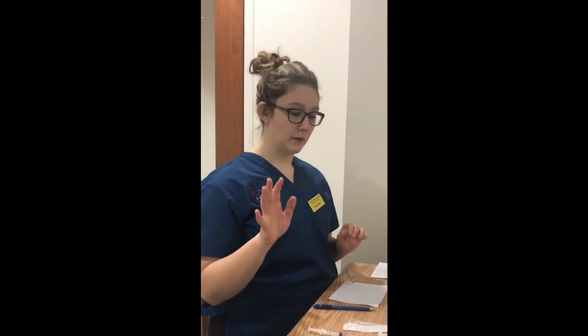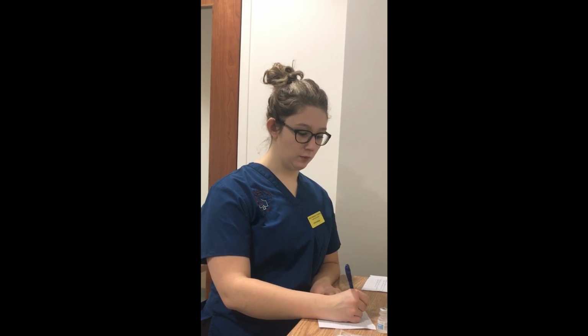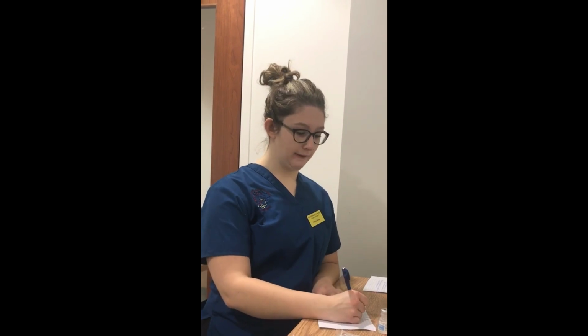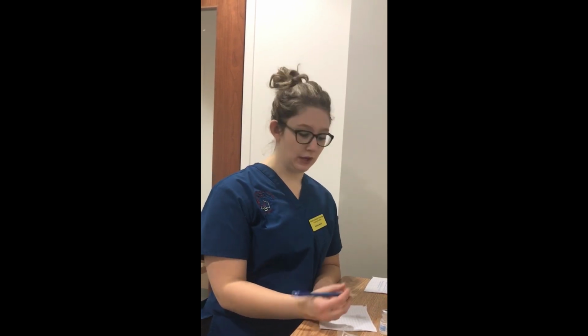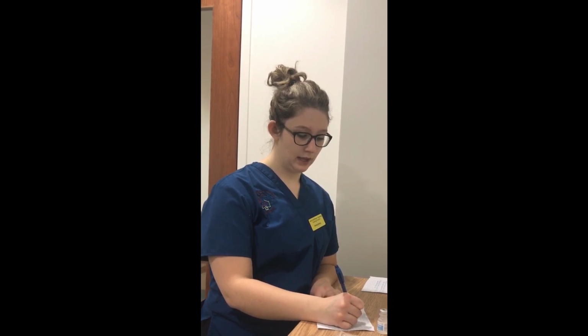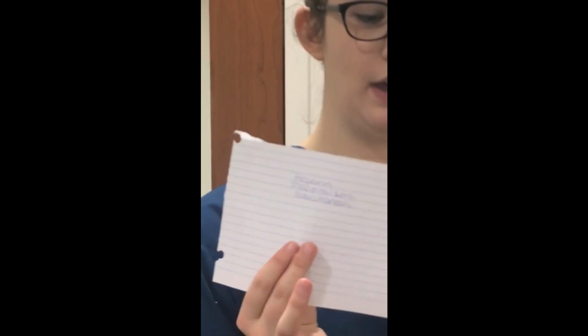And then you would apply a medication label to the syringe. It would include the drug medication, which is heparin. It would label the concentration, so it's 5,000 units per 1 ml, and then the route in which you're going to give it, so it would be subcutaneous. And this is a label that you would then put onto the syringe to cover, so that if it gets set down, then we know what is in the vial.